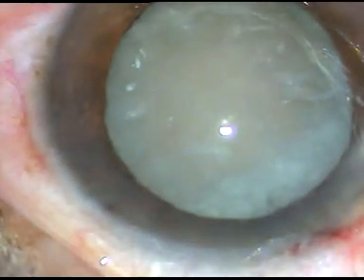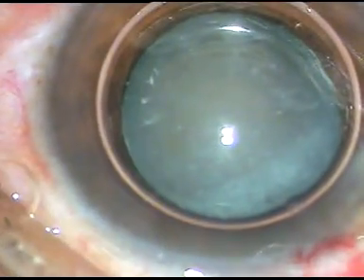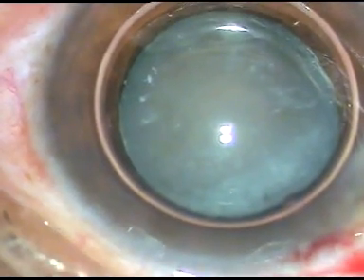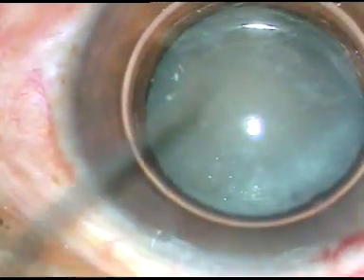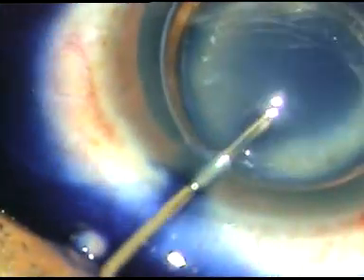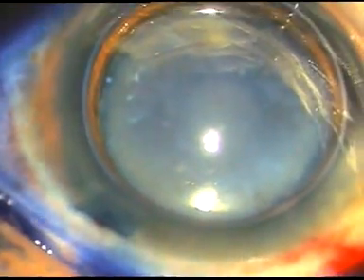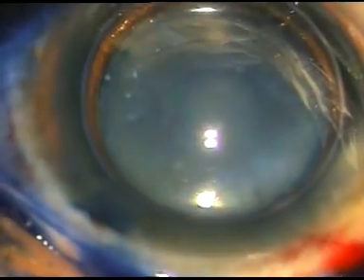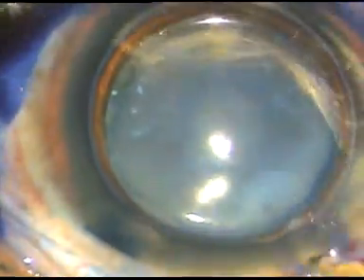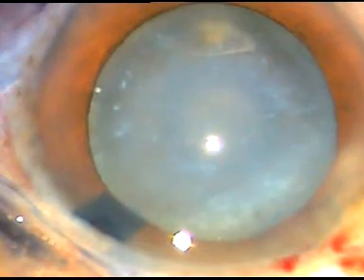This is a white cataract and I am going to stain the anterior capsule with trypan blue dye. I have injected an air bubble, and here goes the dye underneath the air bubble. After about 6–7 seconds, the dye is washed out using a Simcoe cannula and BSS to wash the dye out of the anterior chamber.